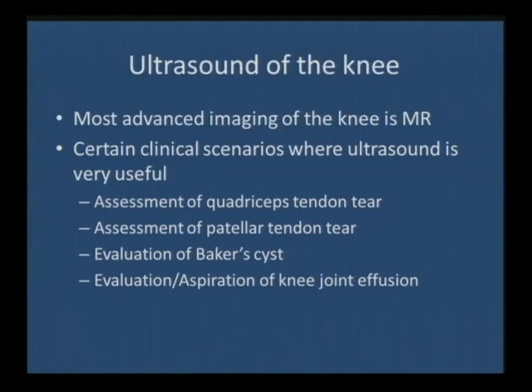I'm a musculoskeletal radiologist and we do a lot of knee MR, so we're not going to say that ultrasound's a better modality than MR. Where ultrasound is very useful is in settings where the clinician has a specific question, in particular assessment of quadriceps tendon tear, assessment of patellar tendon tear, evaluation of Baker's cyst, and evaluation of the knee joint effusion and possible aspiration.